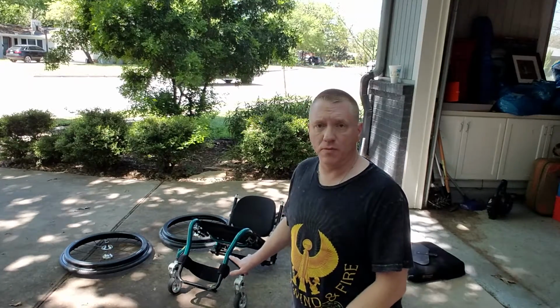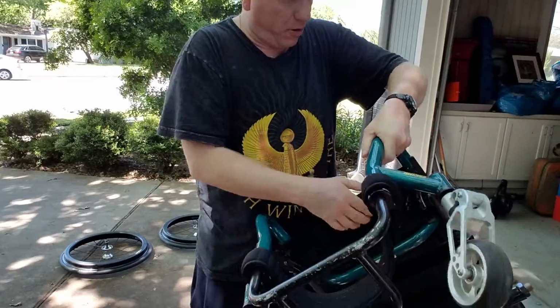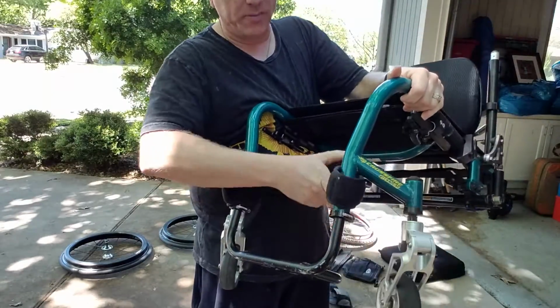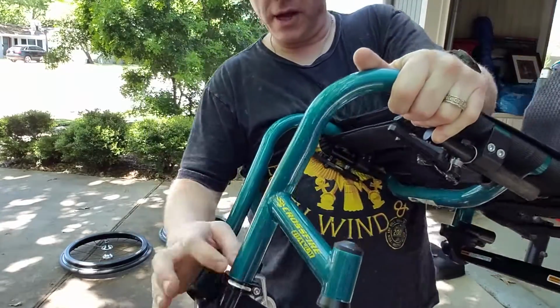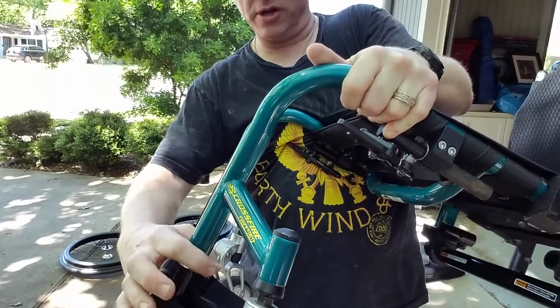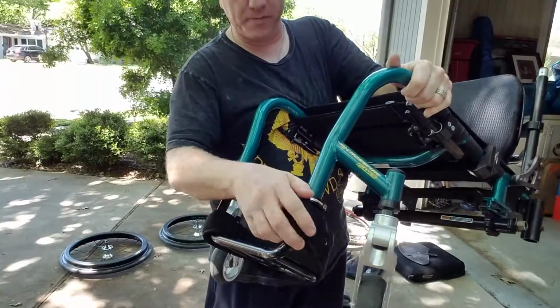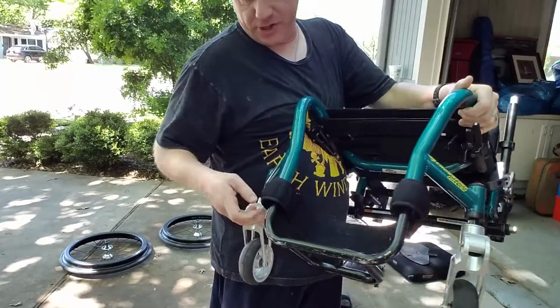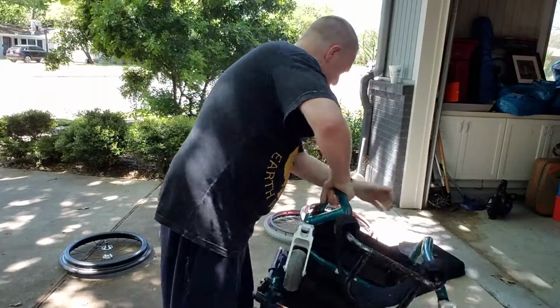One thing to note though, before I get started, I wanted to show you how this bottom part of the wheelchair, right here where the feet go, is adjustable in case it's a little too high or a little too low. You've got these little things here with a hex wrench. You can loosen that, and then this can go down or up as needed to get a better height fit. This, I suppose, could come off as well. It just velcros on, and this holds your legs in place when your feet are resting in the wheelchair.